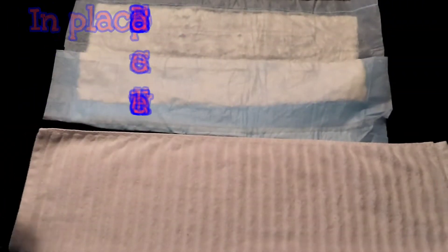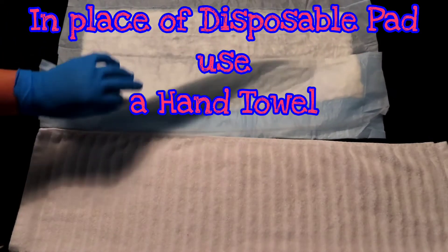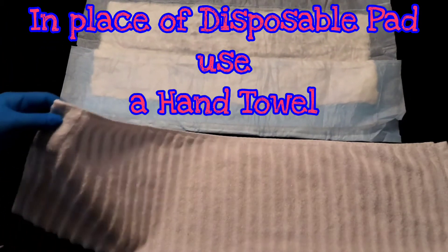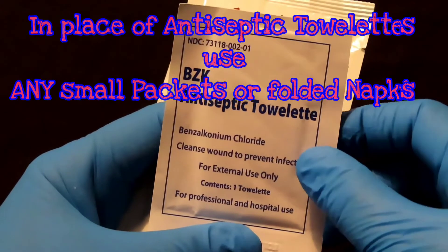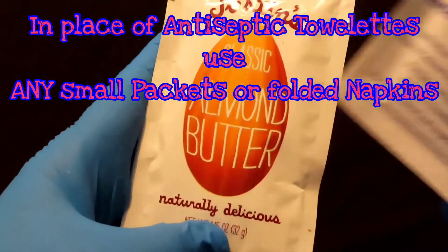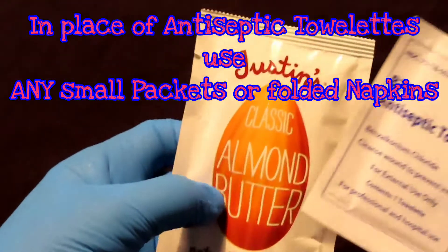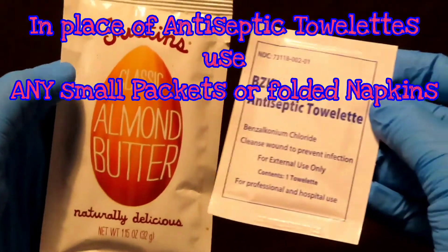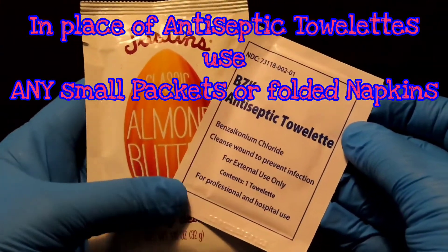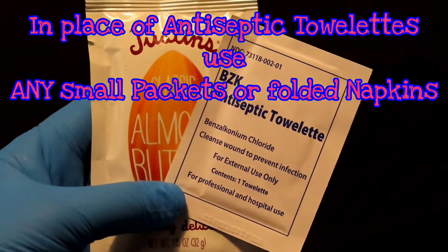The most comparable item to a chuck or a disposable pad is a hand towel. I substituted the BZK antiseptic towelettes with a package I found. Even though I won't be opening this for cleansing, I'll simulate opening the package and having three of them so I can clean the mannequin from top to bottom, medial to lateral.